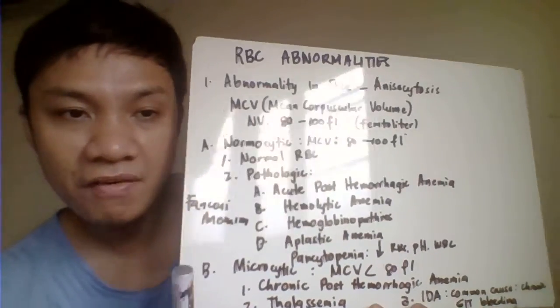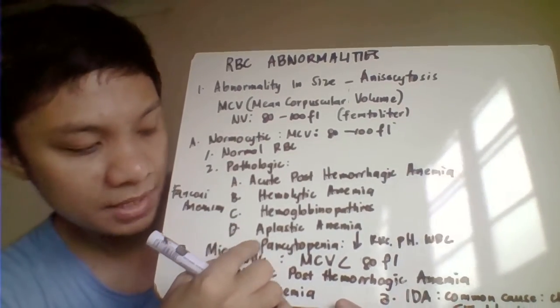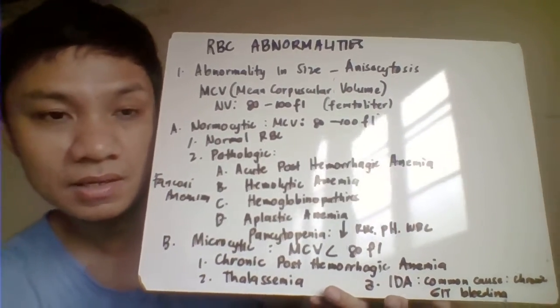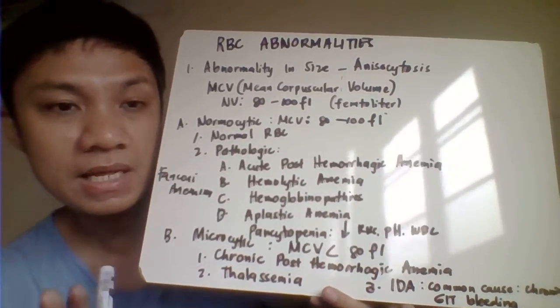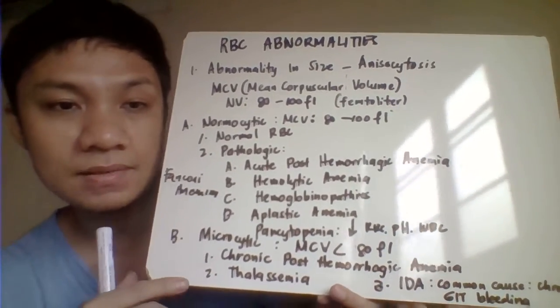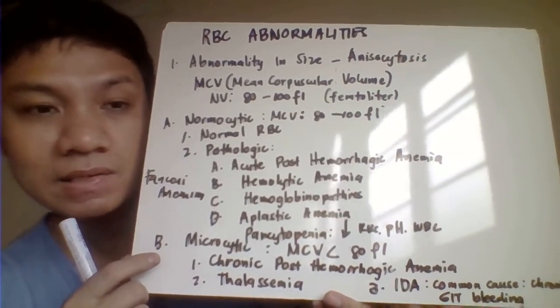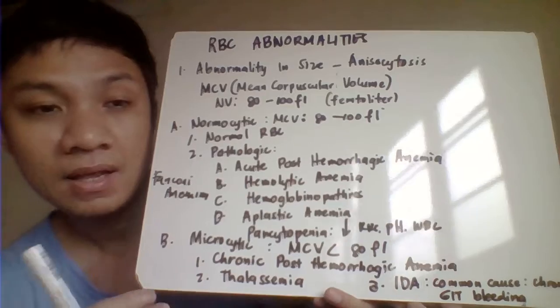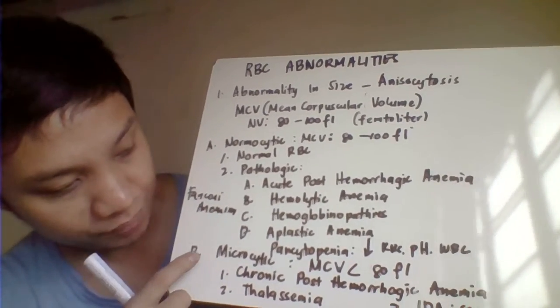Okay, we have here your Fanconi anemia. Fanconi anemia is a type of your pancytopenia. So this is characterized by the decreased production of the bone marrow here of your RBC, WBC, and platelets. Kaya pancytopenia, lahat ng blood cell production ay affected. Magkaiba ito sa Fanconi syndrome natin na mini-mention sa AUBF natin sa analysis of urine and other body fluids.